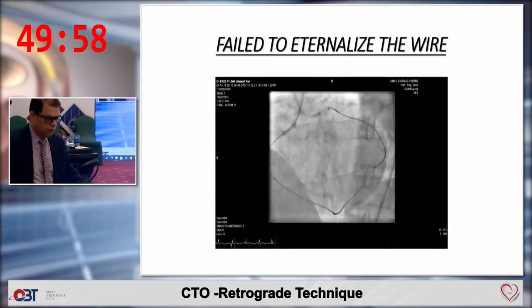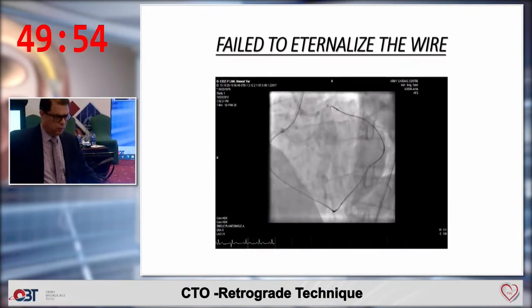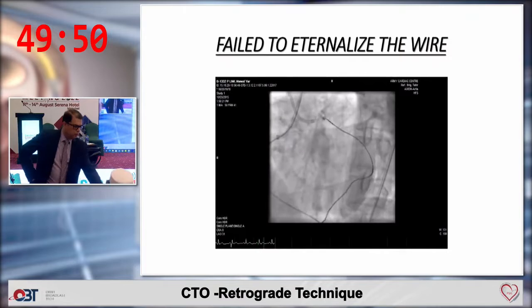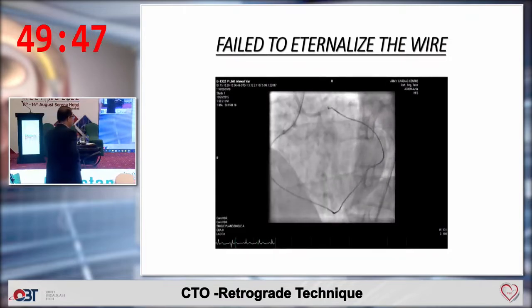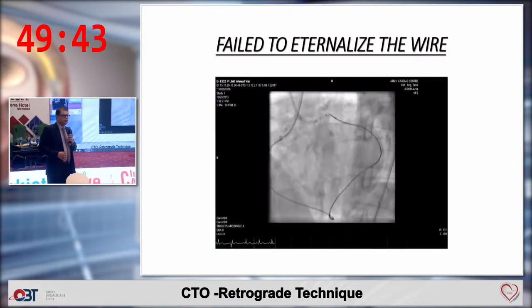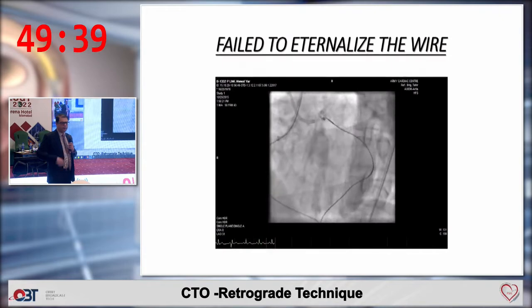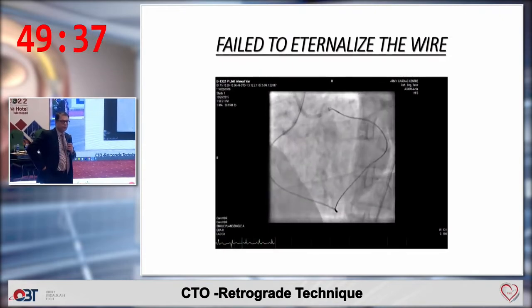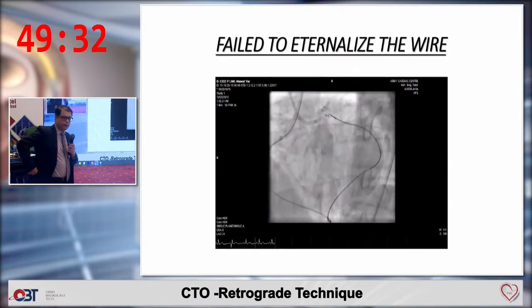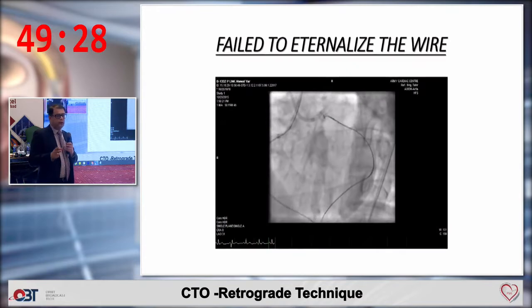What should we see in order to decide that we are switching from antigrade to the retrograde approach? Well, this is a very good question because nowadays you should try and do a CTO antigrade as much as possible. The reason being that there is a lot of data coming which shows that the complication rate in CTO when you do retrograde is very high. So it should be a last resort.